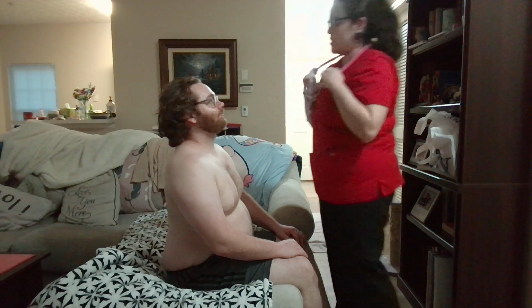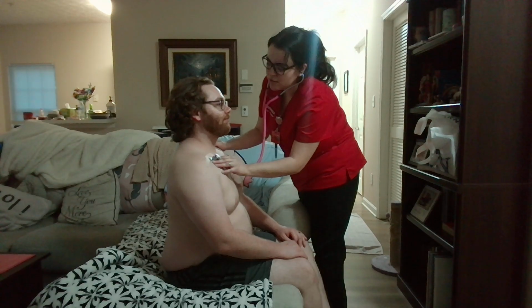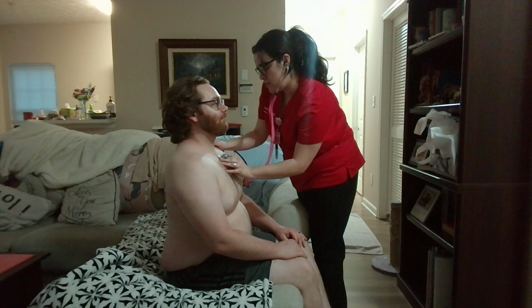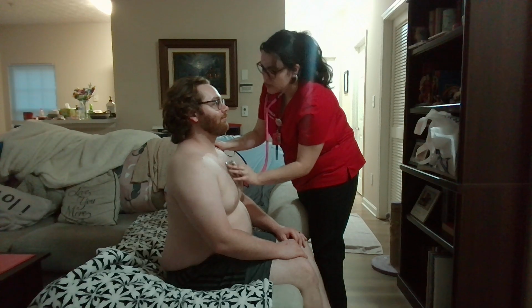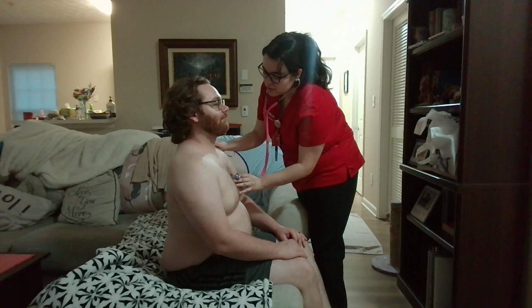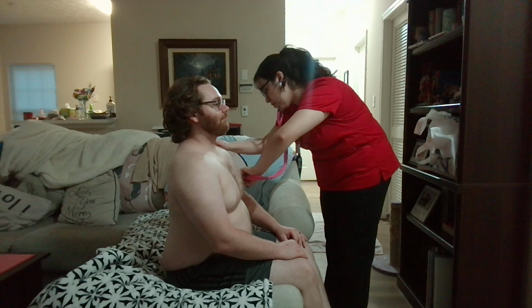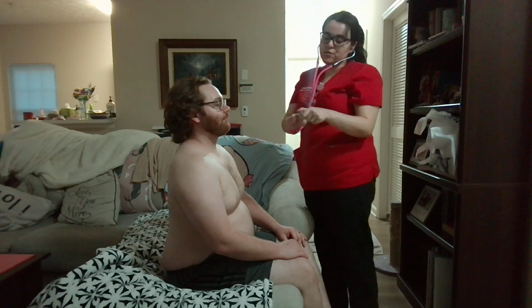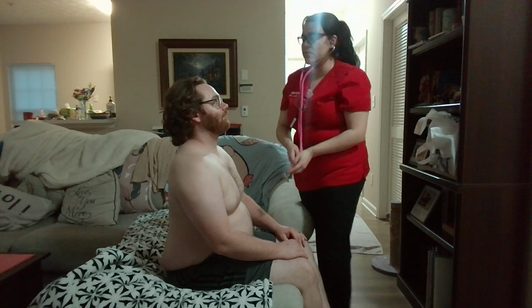Okay, very good. I'm just going to take a quick listen here. I'm going to auscultate, using the diaphragm of my stethoscope. Very good. S1 and S2 are normal. No S3 and S4 noted.